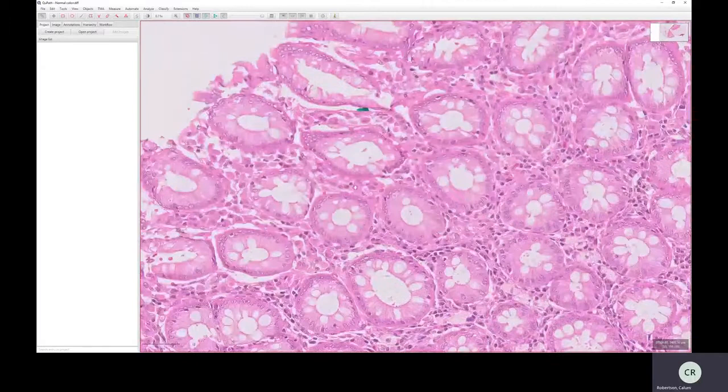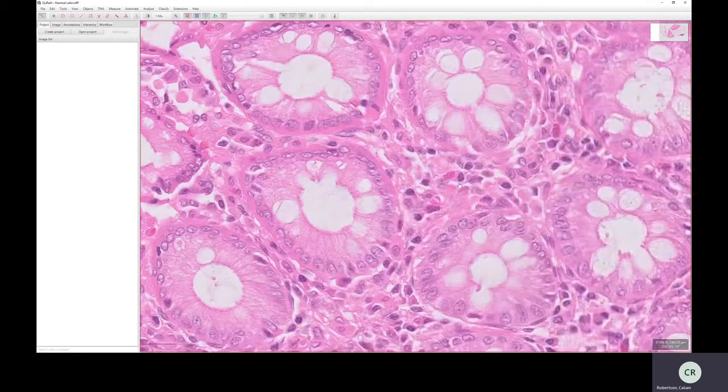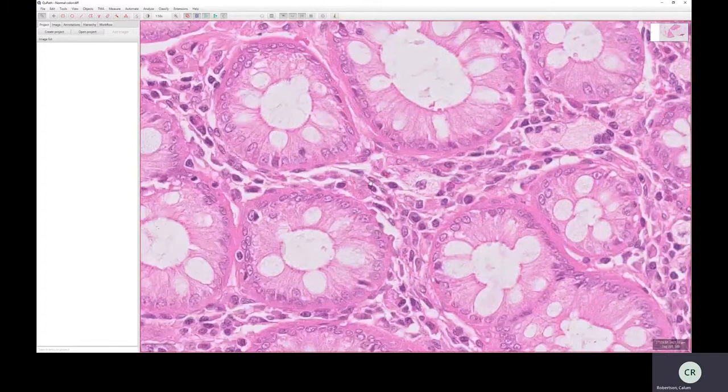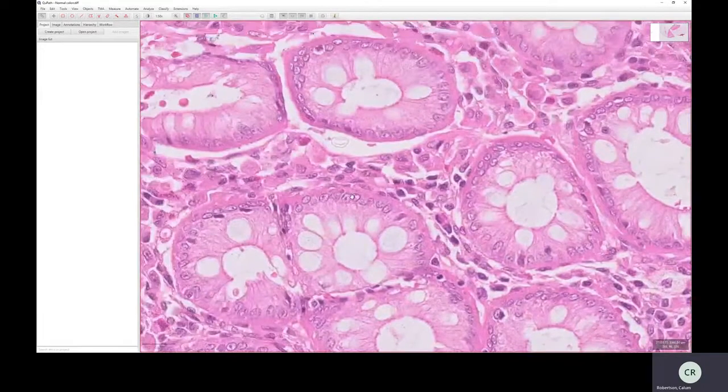It's another blood constituent cell, and they're not present normally in skin, but they are in colonic biopsy, and that's these cells, these bright pink cells, called eosinophils. Eosinophils are eosinophilic, intensely pink, hence the name, and they're a granulocyte. They've got this intensely pink granular cytoplasm, just these little granules which pick up intense eosinophil staining, and sometimes you can see a bilobed nucleus.